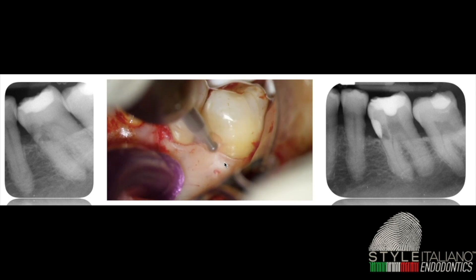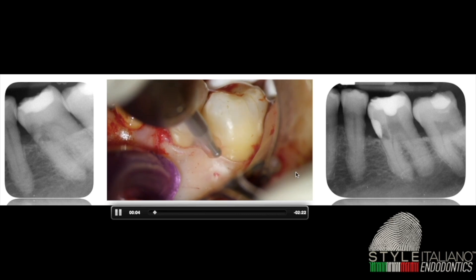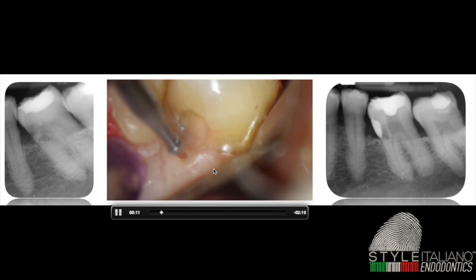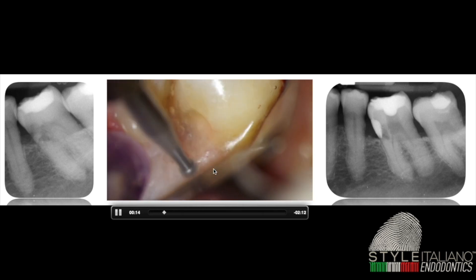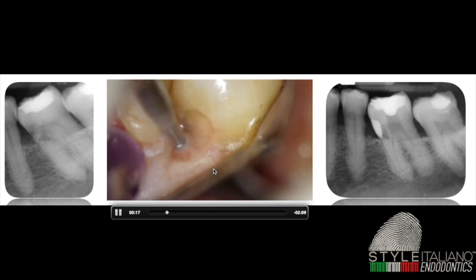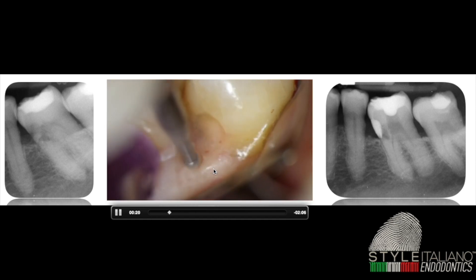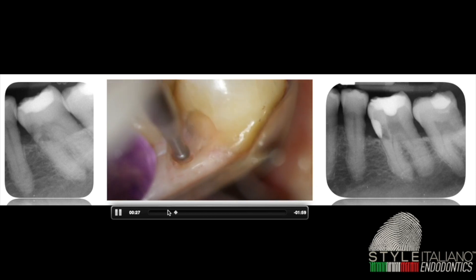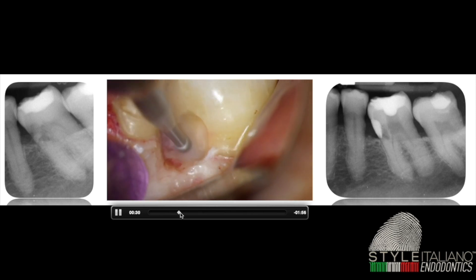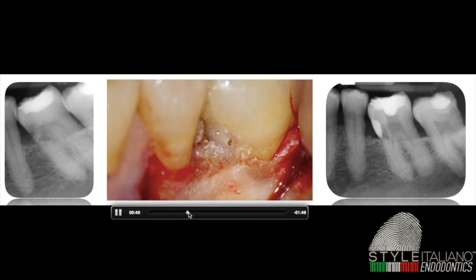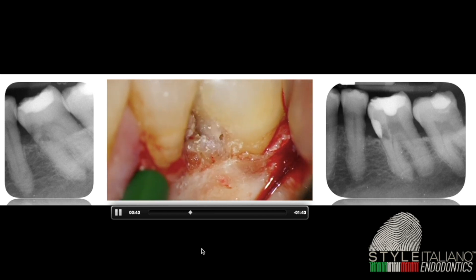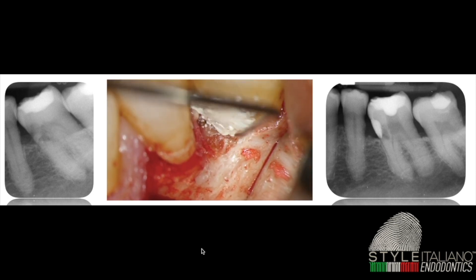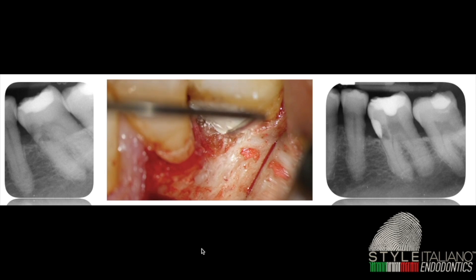I opened a flap and removed all the bone that is growing inside. Here you can see perfectly what it means — you can see the bone growing inside the tooth and you are not able to identify what is bone and what is tooth. I started cleaning everything, because you have to clean if you want to place the material properly. After a few minutes of cleaning, I found the communication between the pulp chamber and the external part. For sure, both cases need a double treatment.